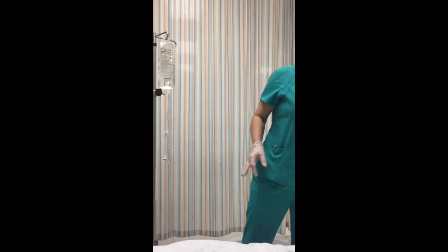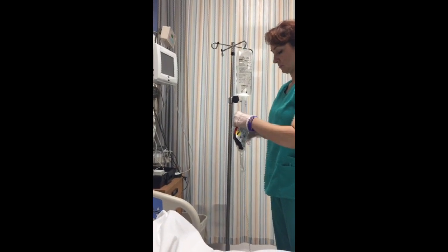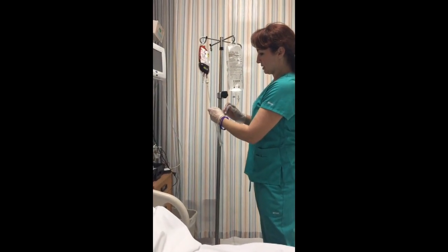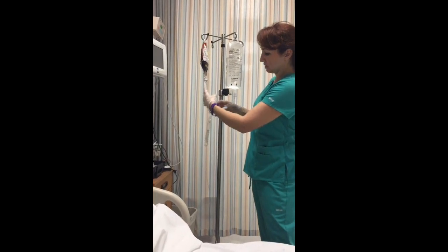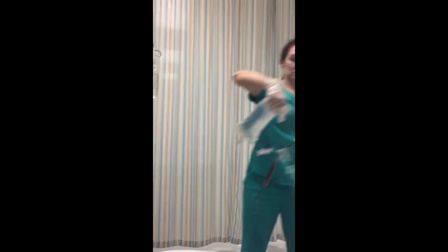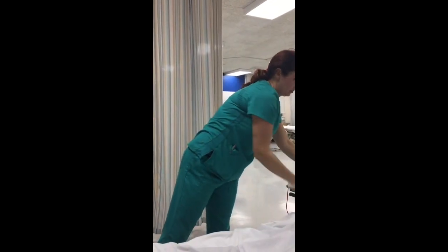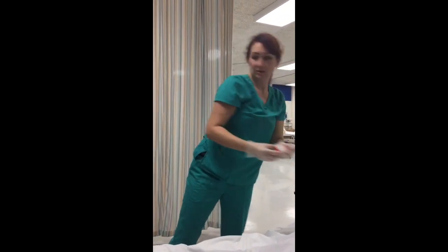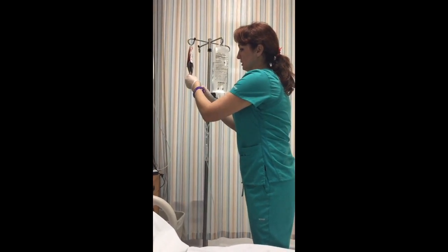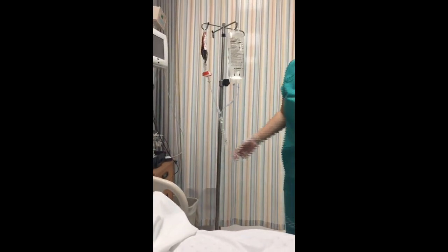We're going to go ahead and spike this, hang it, close the saline fluids, and open the blood to prime. You'll see the blood mixing with the saline in here so you can get an idea of what that looks like. If a second filter is required, it'll look like this.